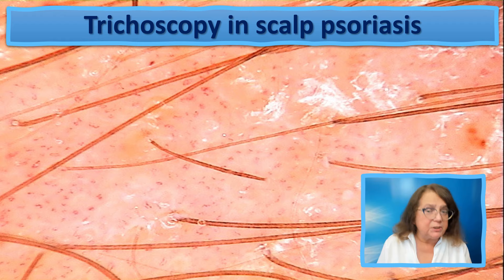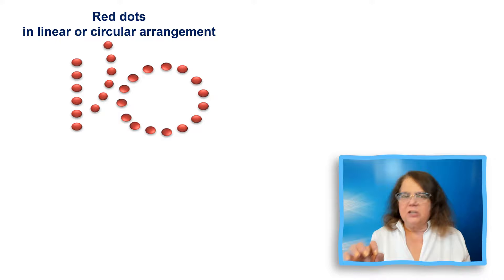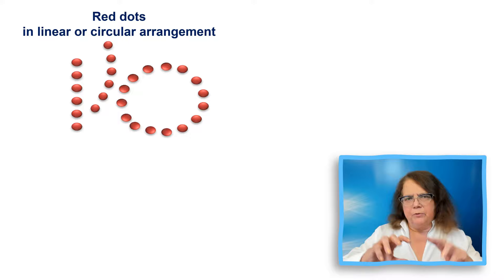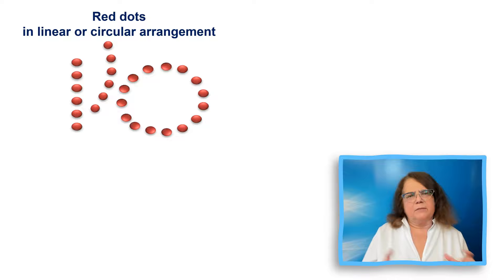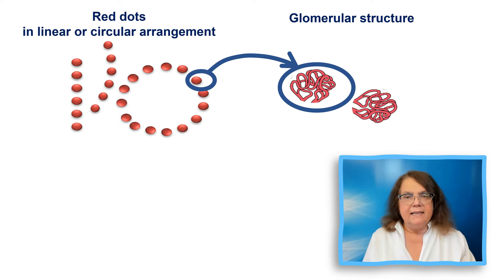This is a typical trichoscopy image of psoriasis of moderate activity with visible blood vessels and some diffuse scaling. A very typical trichoscopy feature of scalp psoriasis is the presence of multiple blood vessels arranged either in lines or in circles. When we use a handheld dermoscope, these blood vessels appear usually as dots. If we use high magnification, for example with a digital dermoscope, we will see that they have a glomerular structure.